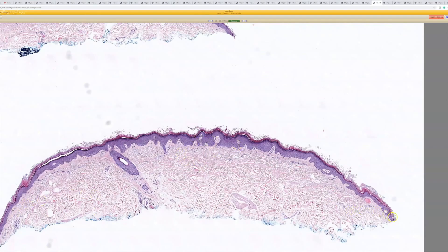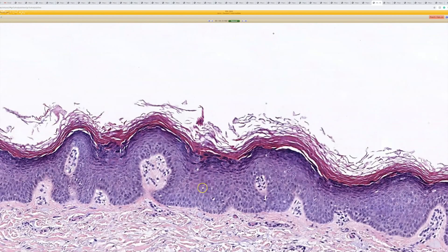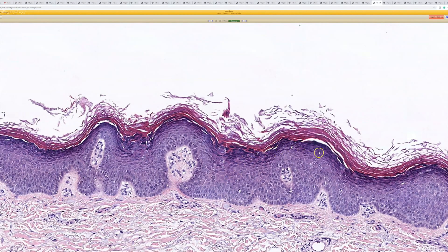Here's the normal epidermis — it's a little acanthotic. And the surface, instead of the nice finger-like projections of a Verruca vulgaris, you have just very tiny little undulating rolling hills. And when you go in closer, you will see hypergranulosis, and that little undulation with maybe a touch of parakeratosis here and there.